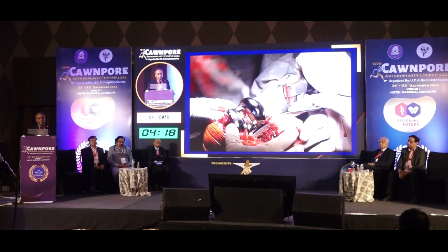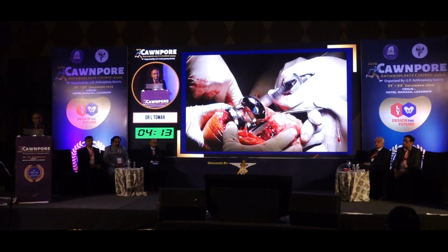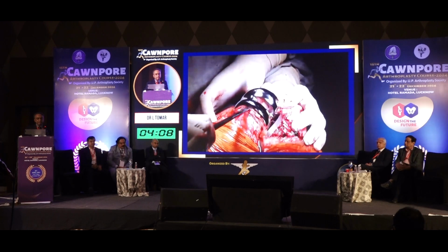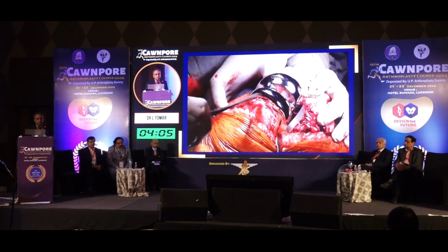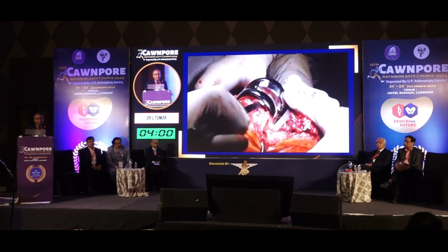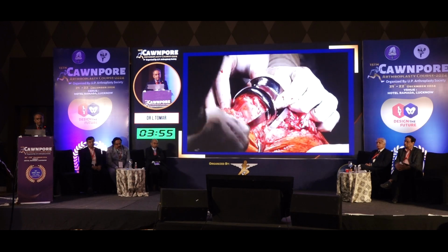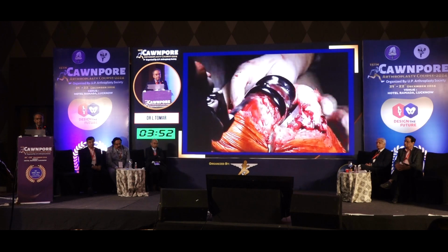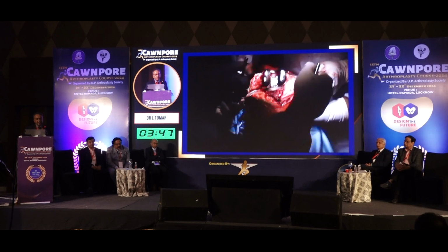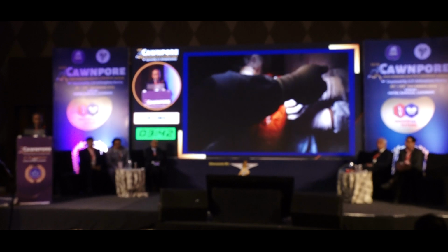Then we try to remove the femoral metallic implant, and that has to be done by disengaging the interface between the metal and the cement, and trying to avoid the interface of the cement and the bone. So with soft blows of the hammer, with a thin osteotome or a thin blade saw, we try to disengage the metallic implant from the cement. In the anterior part, we can disengage this using a Gigli saw.